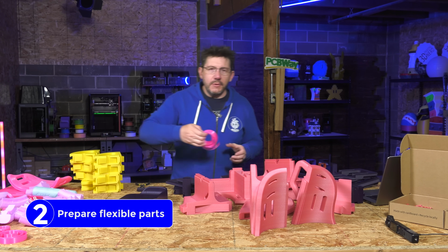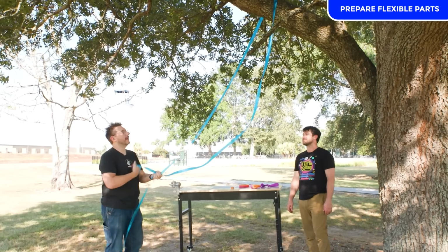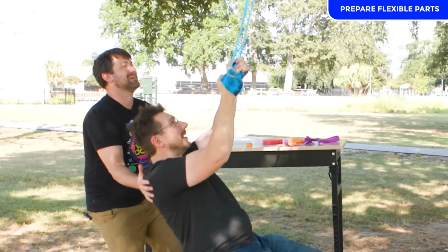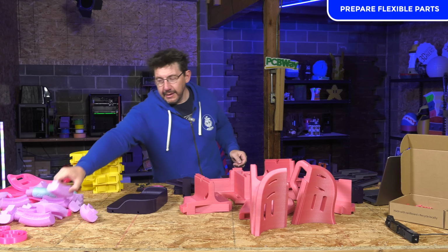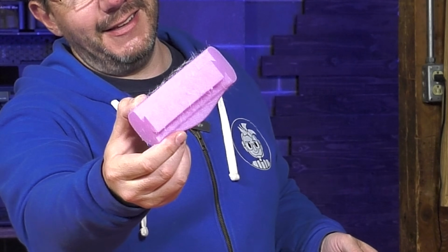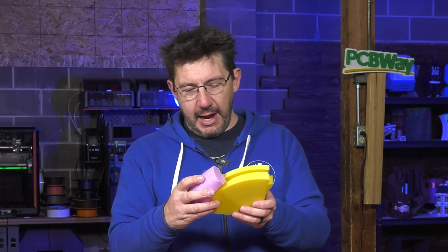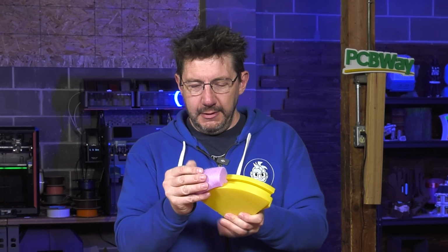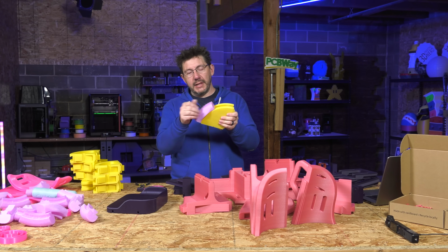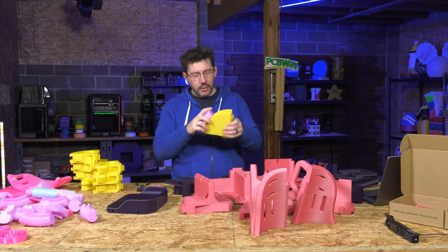So I'm using CookieCAD TPU here, and we've shown you the strength of TPU when being used as a strap. I did get some hairiness. A lot of wisps on those prints. I will be able to slot these in, and then once they're in place, I will run a torch around them just to get rid of what's visible.